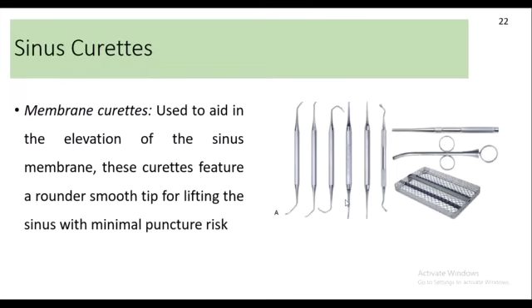Now coming on to the sinus curettes, which are used to aid in elevation of the sinus membrane. They have a round smooth tip for lifting up the sinus with minimal puncture risk.